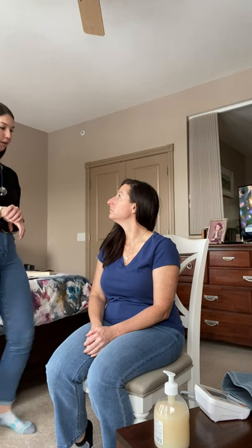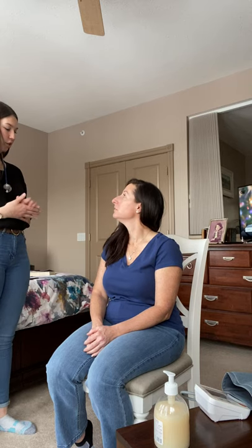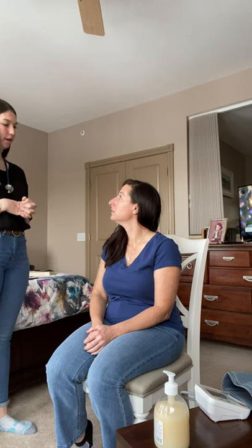Everything with the rate was good as well. It was 14 breaths per minute, which is right in the range of 12 to 20 for someone your age. The quality of it was good and the rhythm was good as well. Your breathing seemed normal — didn't seem like there was any extra breath taken or too deep of a breath. Everything was good.